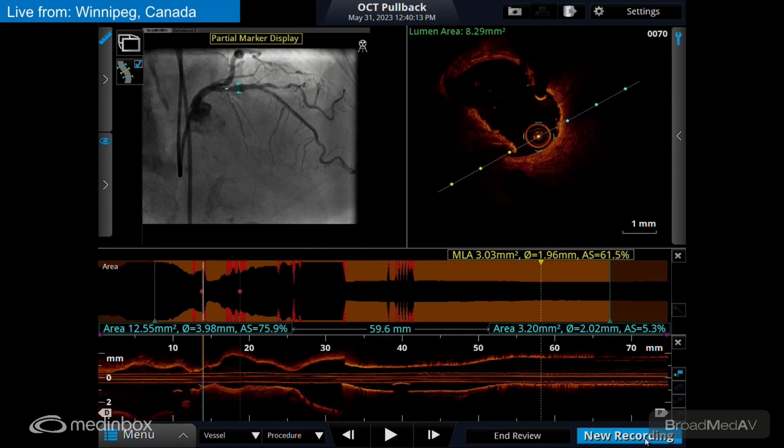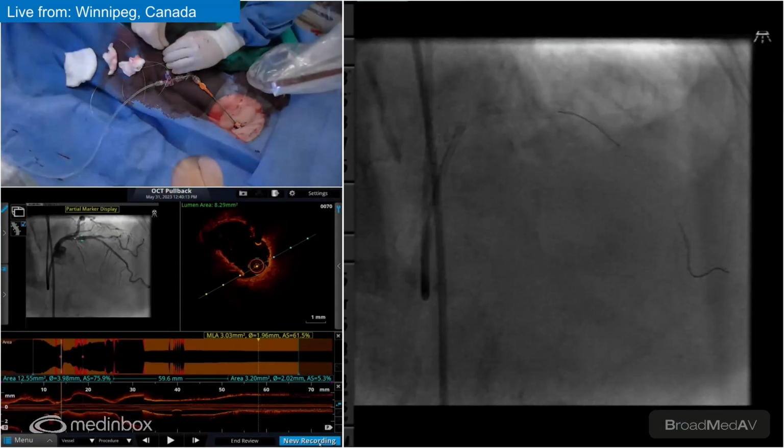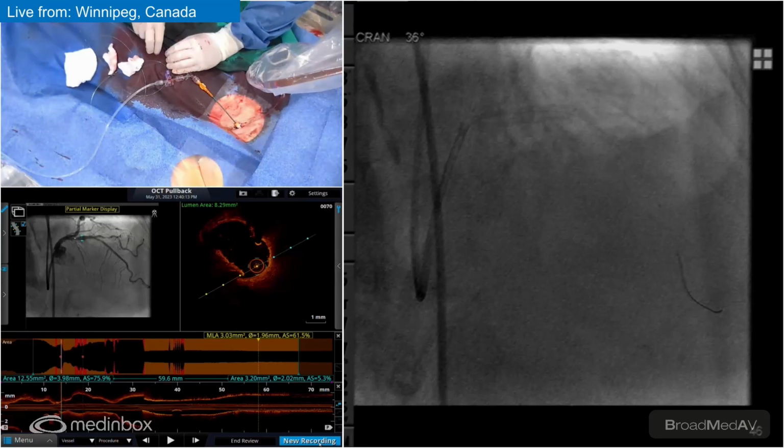15 or so. All right, Sheila, I'll give you this back here, please. Yeah, that looks good to me. Great. Just get the wire as deep as possible. I think we're done with the rota. What do you guys think? We're not going to go bigger than that. We're not going 2.2. So there we go, we're out with a 2.0. We're out with the rota wire. I'm going to hand this out. I'll give you this, buddy.